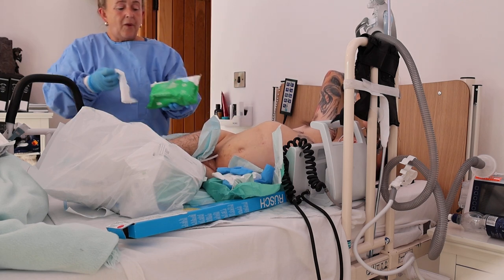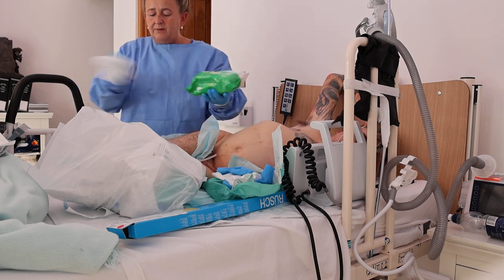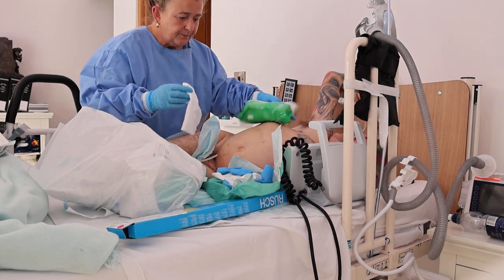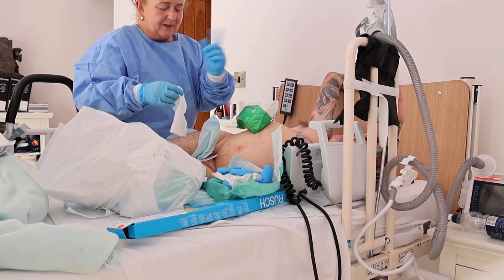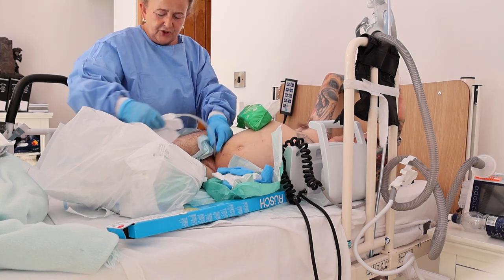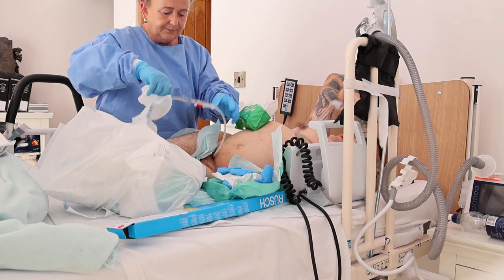You can do this another way. If I wasn't filming, I'd do it from left to right really quick with my trolley in and out, but I've done it as slowly as I can to show people. Oh, the blood pressure has gone up. The blood pressure is 177, and I expected it to go up. What I'm also going to do is get my clinical wipe and just wipe the tube. Is it all clear now?